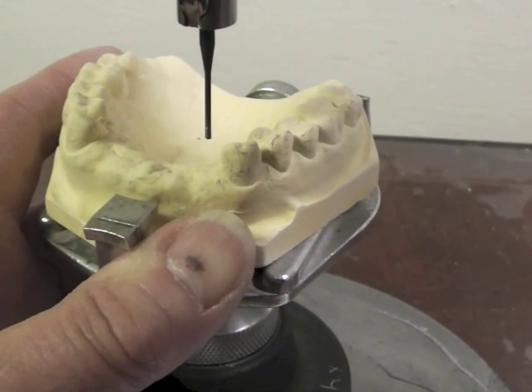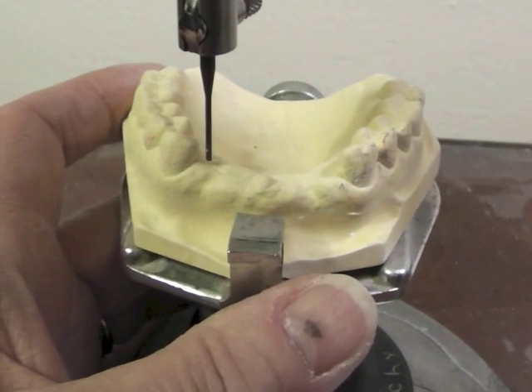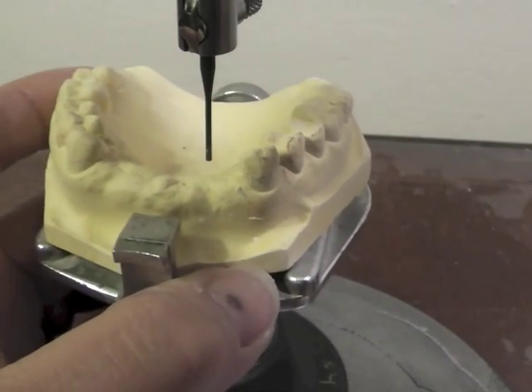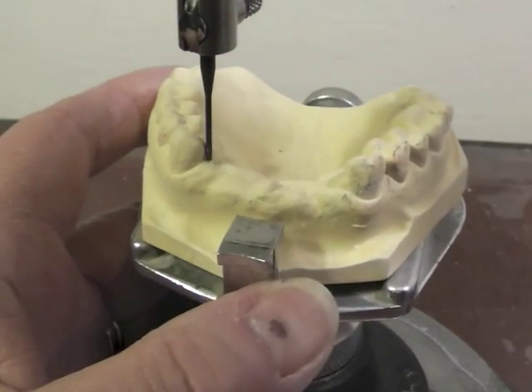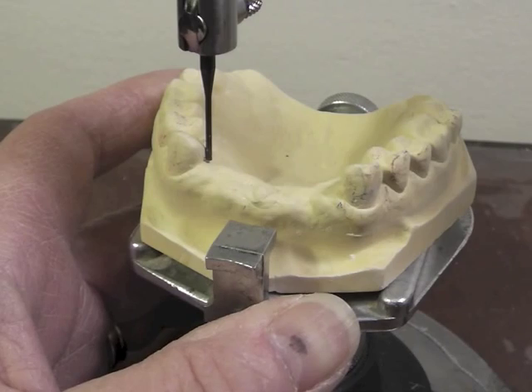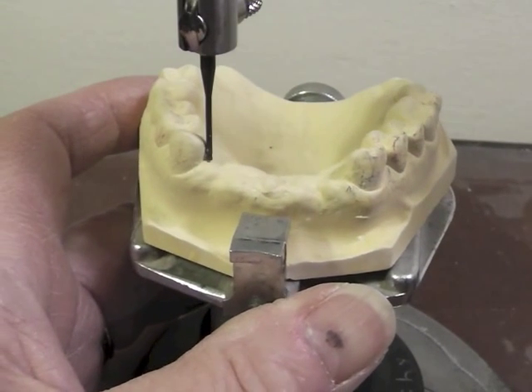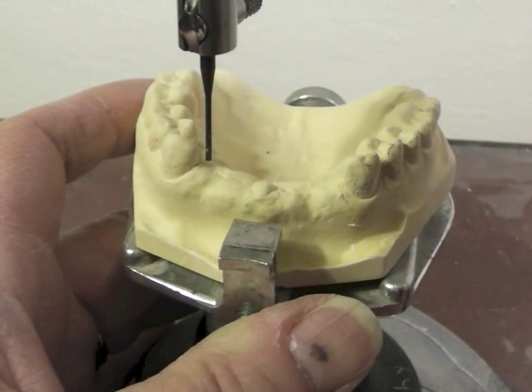The first thing we're going to look for is guiding planes. We want to see whether we can create parallel surfaces on the mesial of these two canines. The guide plate would be right behind the cusp tip back to the cingulum area. We would like to see that surface relatively parallel to our analyzing rod. We're not far off when our plane is level with the floor, and it won't take much to get them perfectly parallel. That makes the partial much more stable.